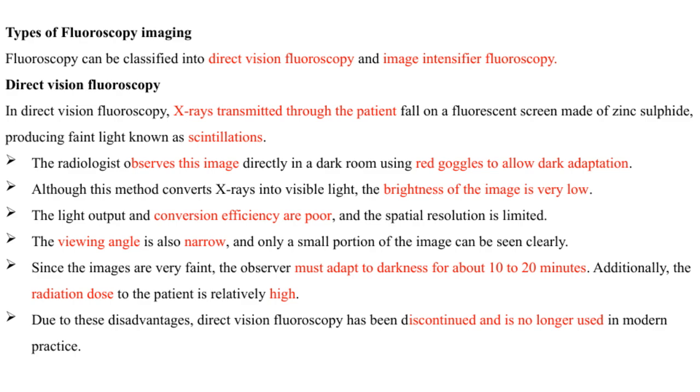Due to these numerous disadvantages, low brightness, poor resolution, limited viewing angle, and the need for darkness, direct vision fluoroscopy has been phased out and is no longer used in modern practice. Instead, we now rely on more advanced imaging techniques that provide better visualization with lower radiation exposure.